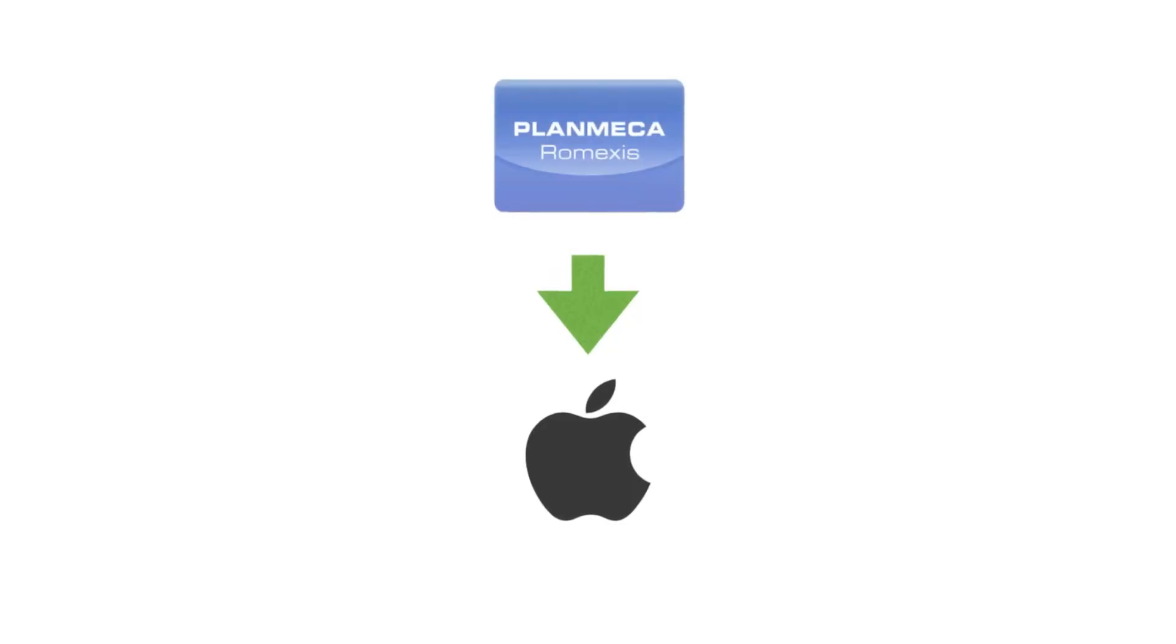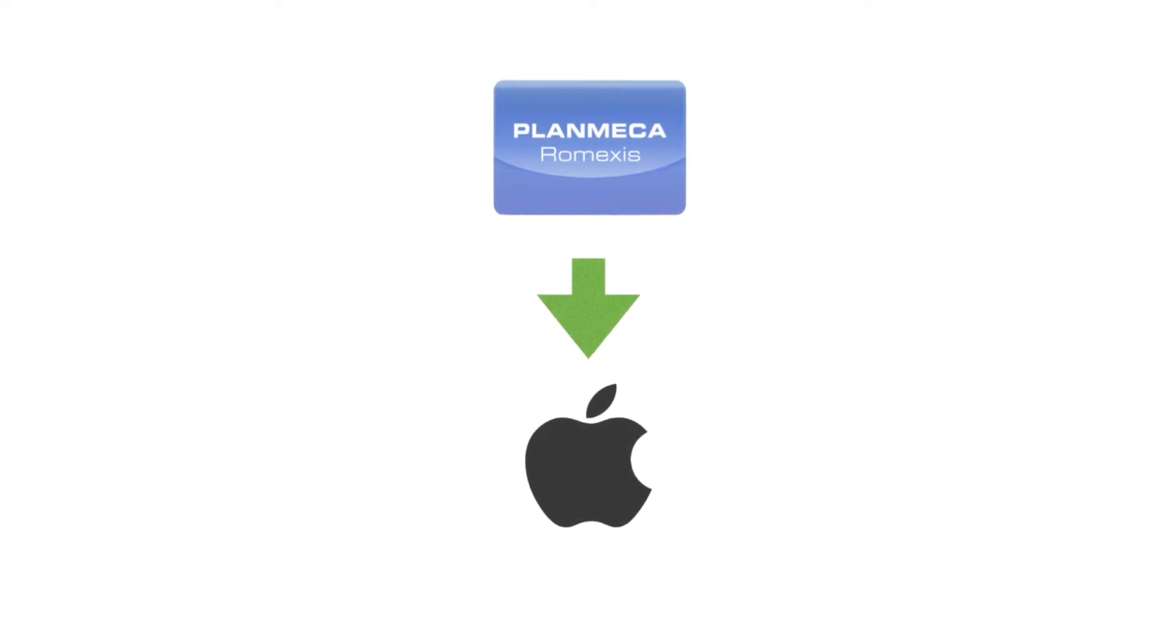Hello again, this is Cody Ray with a very quick Planmeca tech tip. Today we're going to be installing Romexis on a Mac computer. Sorry Windows guys, you're gonna have to learn.